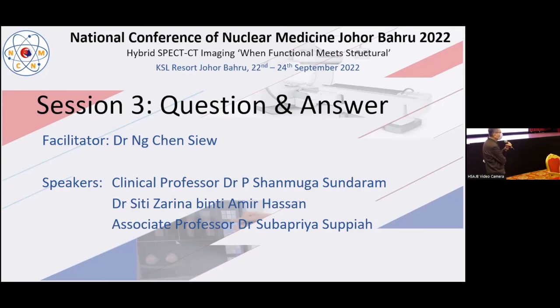And later on, we continue to follow up 2 hours and 4 hours later. We try to combine the best of the two. Now, the question is, noted from your presentations that your centers tend to use solely dual phase study. What is the comment on the difference on these two from your experience?